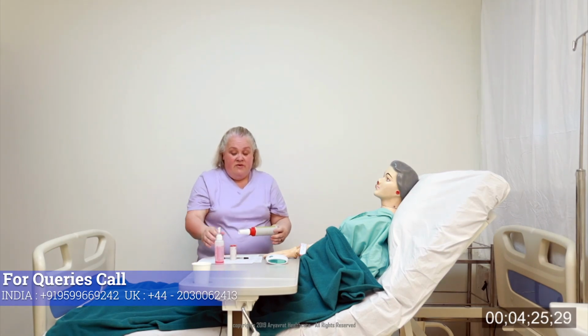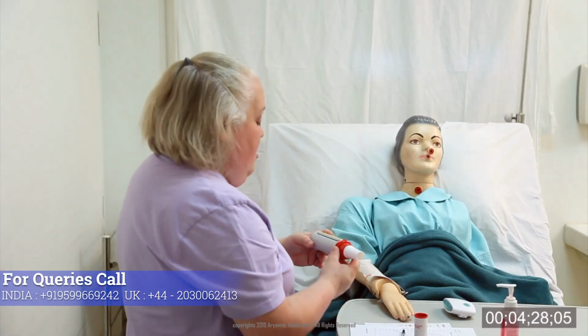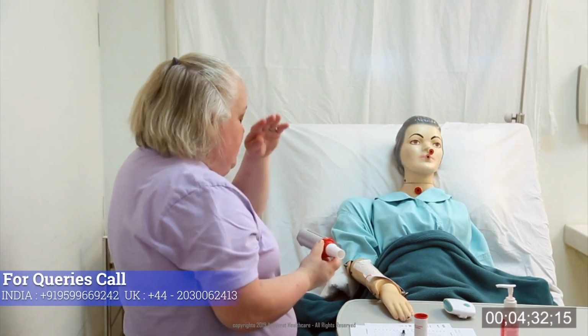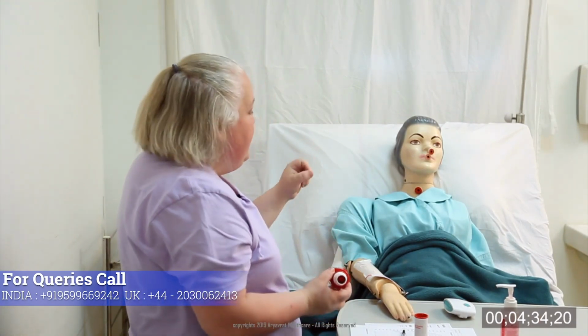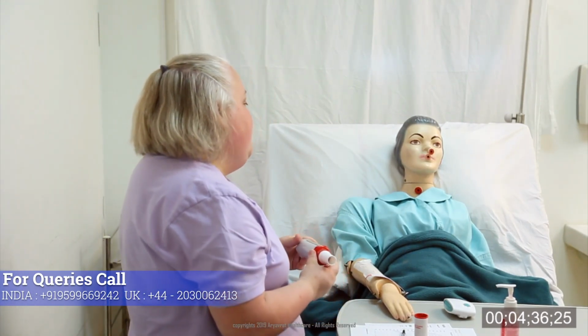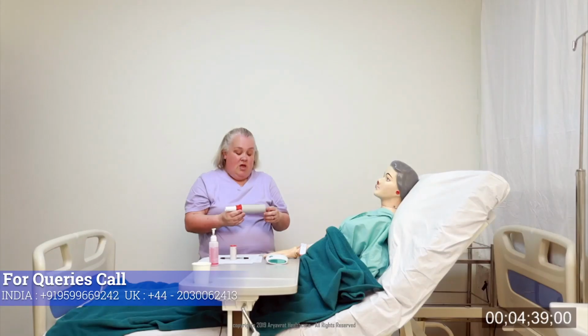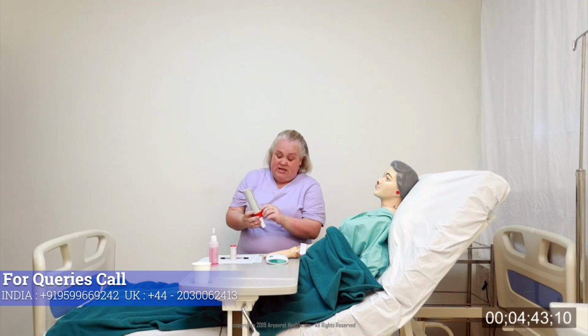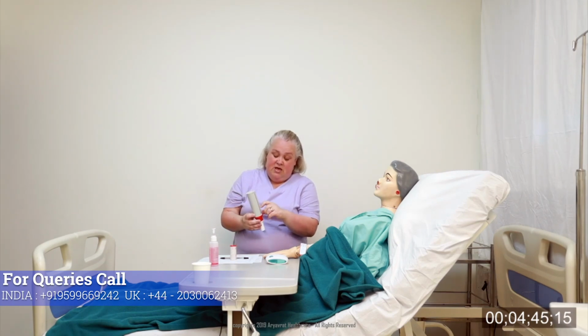Okay. Are you with me so far? Yes. Okay, so when you've taken your 3 readings, you need to take the highest one, and that would be your measurement for that day. Okay? However, can you see that these measurements are done in litres per minute?